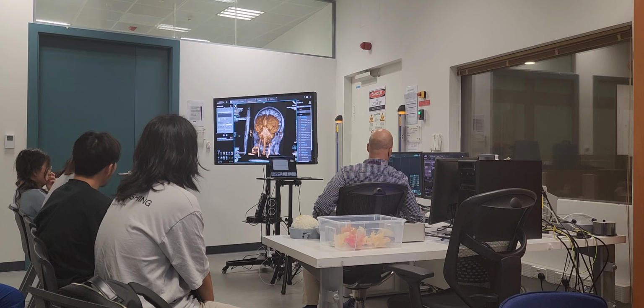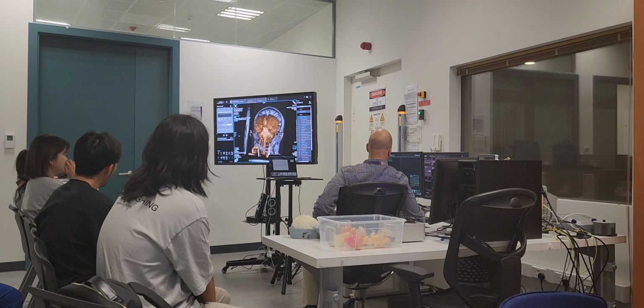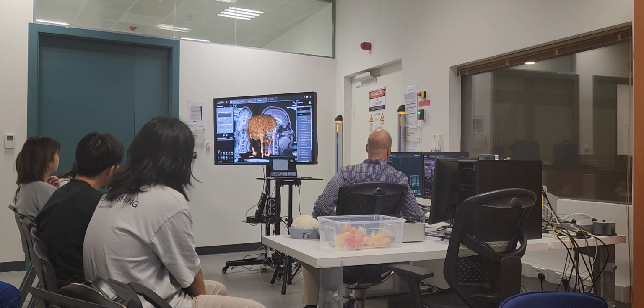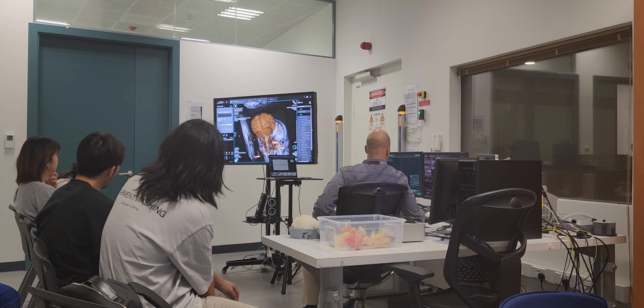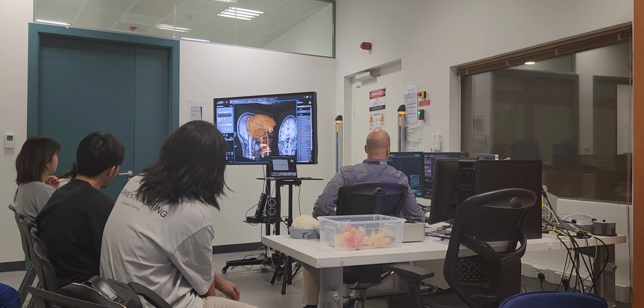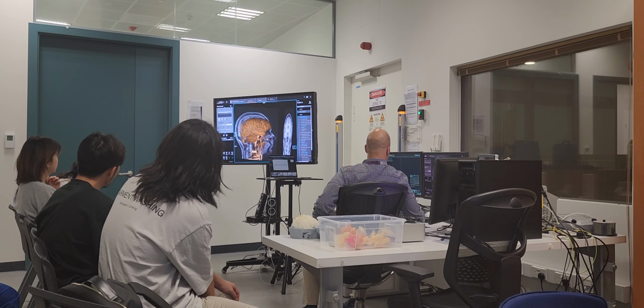Okay. Here are the carotid vessels. These are the vessels that feed the brain. You see here the spinal cord. Okay. You see the cerebellum here. Okay. You see now we are looking at the lateral view here. Okay. So now where is the motor area?